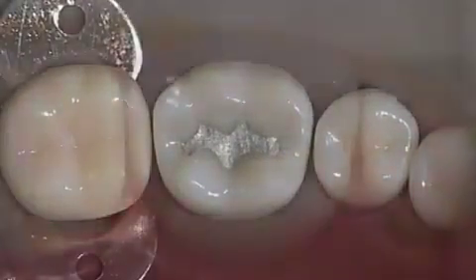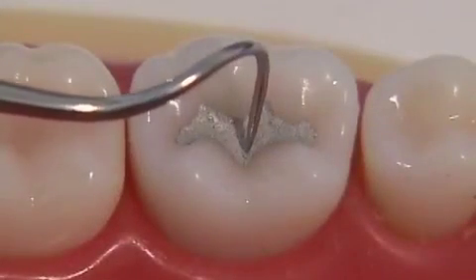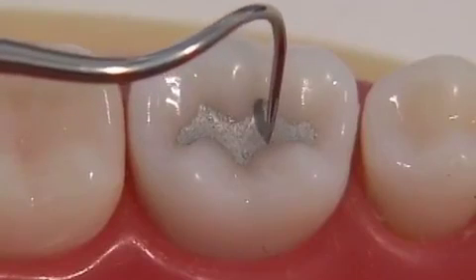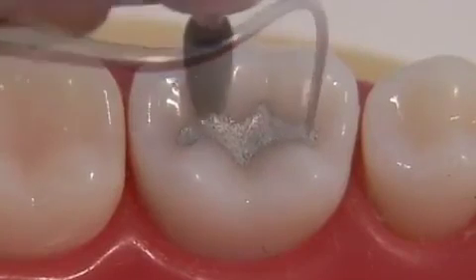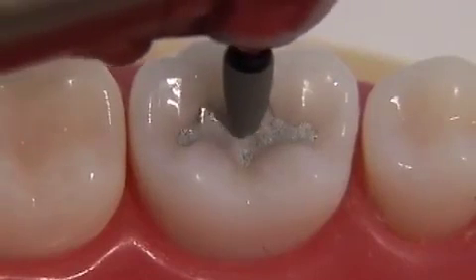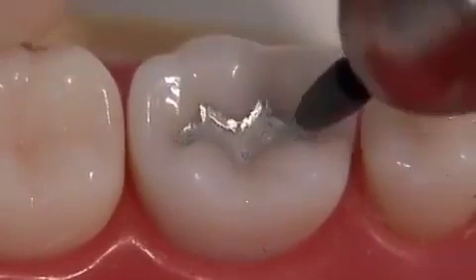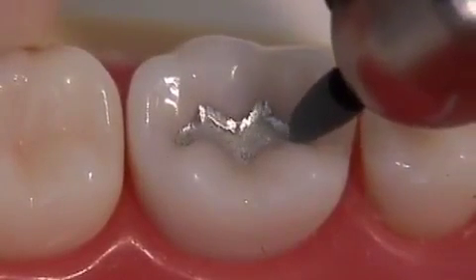Amalgam develops its final strength at around 24 hours, so ideally you want to wait this long to polish. You can confirm that the amalgam is fully hardened with the tip of an explorer. An abrasive greenstone or round burr is used to polish the surface. A rounded end is preferred to avoid gouging and scratching the material.